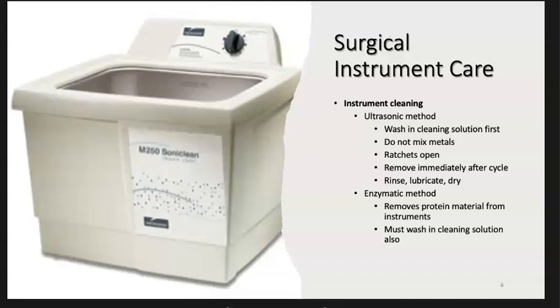Once your instruments are visibly clean, it's important to keep your ratchets and box locks open prior to putting them in the ultrasonic machine. It's important to not overstack your ultrasonic machine full of instruments, as this can be damaging to delicate parts. Also, do not leave your instruments in the ultrasonic for longer than one cleaning cycle, as it could lead to rusting of the box lock and ratchets.